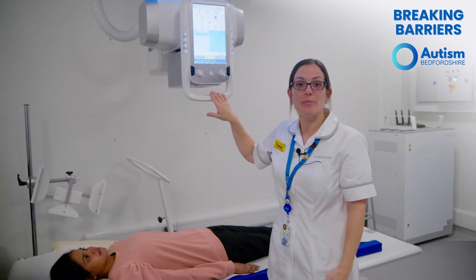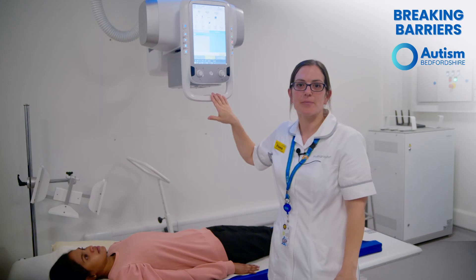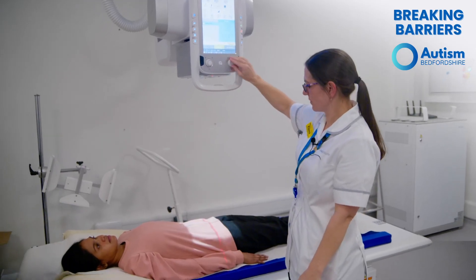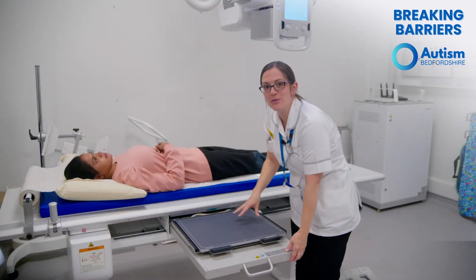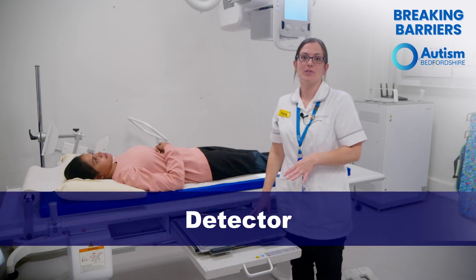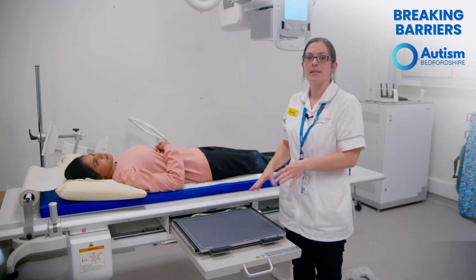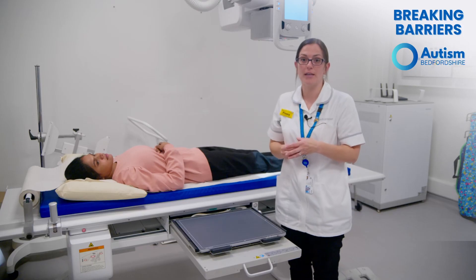The radiographers can press buttons on the tube to get everything just right for the x-ray, including a light that will shine on the body part being x-rayed. This is what we call the detector, and the detector helps to record the picture. Sometimes the detector stays hidden inside the equipment, and sometimes we need to put it underneath the body part we are looking at.